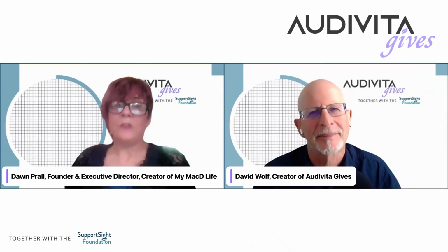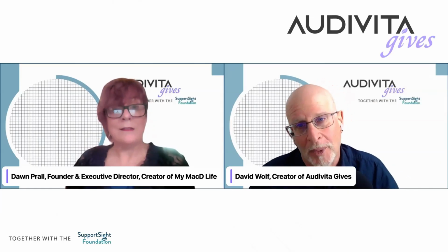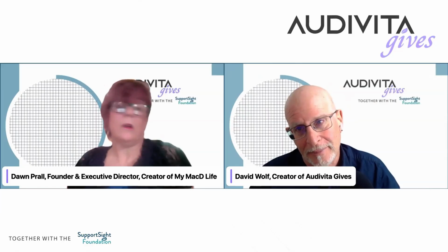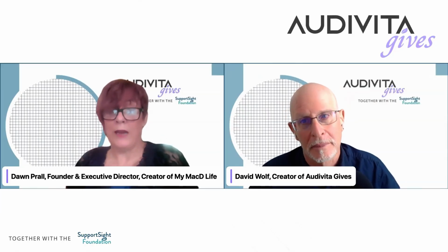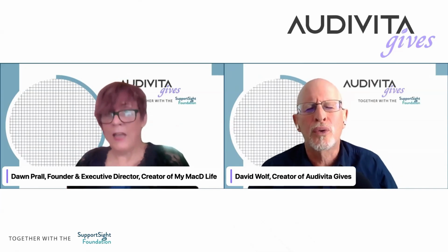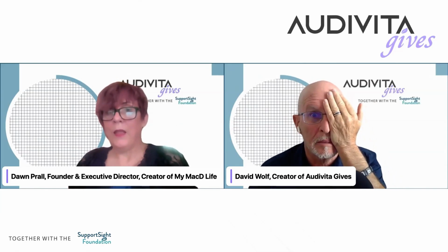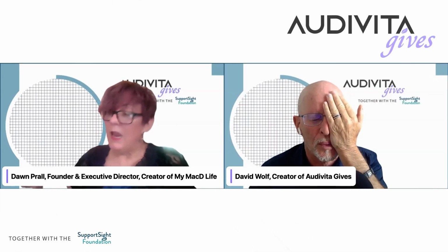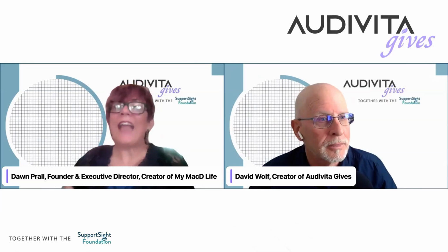Your retina is your camera. So when you have a retina disease and it's your central vision, just close your eyes for a few seconds. Take a break, a breath or two. Breathe in, calm, and then do your other eye and test that. It is that simple.